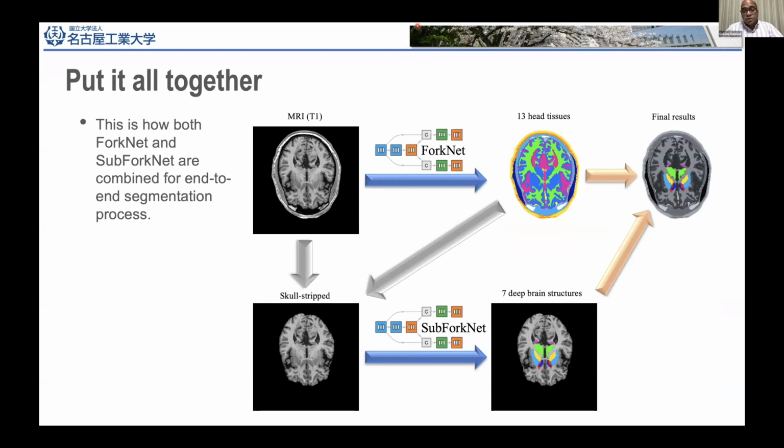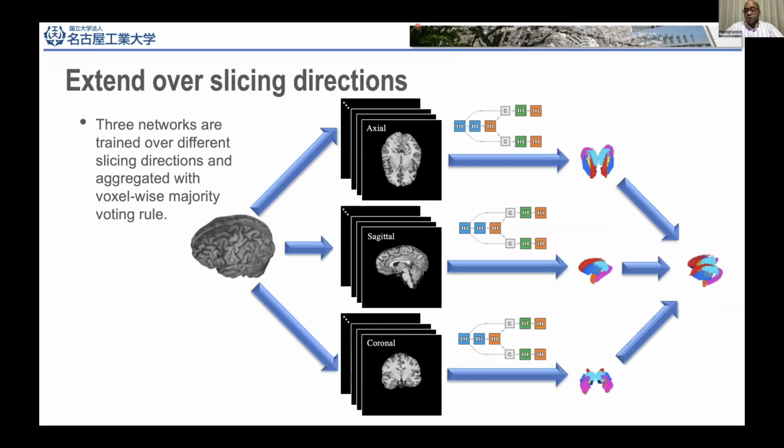Okay, so for the segmentation, yes, this is a 2D segmentation actually. And we can say it is 2.5D because we do the 2D segmentation along different directions and then we combine all of them. So this is what we call 2.5D. Okay. That's the first question.